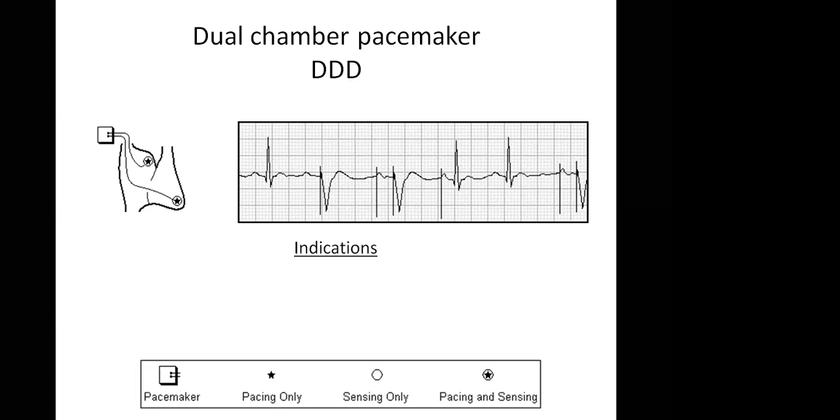Anyways, it's more of a dual chamber pacing because, from the ECG, you can see there's pacing of both the ventricular chamber and the atrium, and at the same time it is also sensing activities, because when it found activities from both the atrium and the ventricle, it did nothing. And if there is no activity, it actually triggers one. So if you follow through the tracing, you do fine. From the tracing, I think that's all.